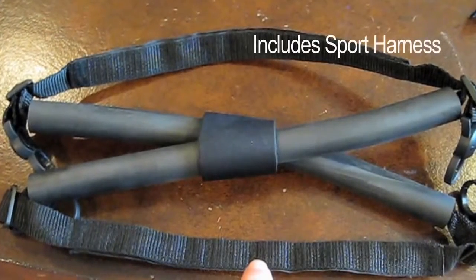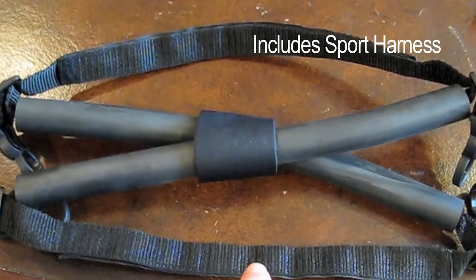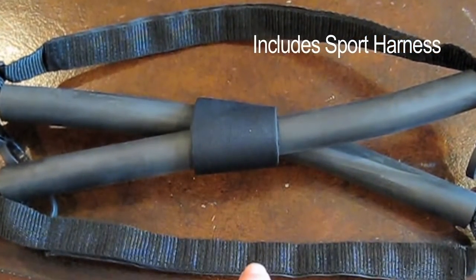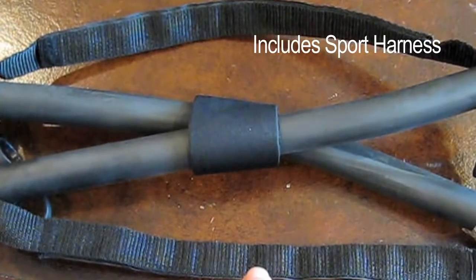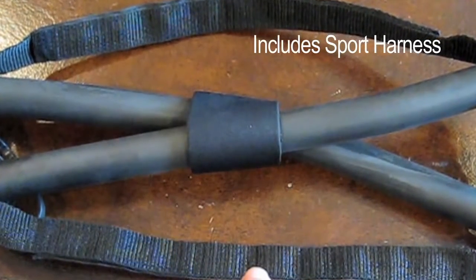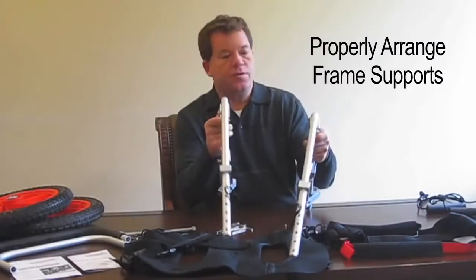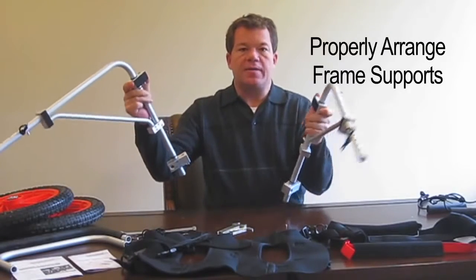Also included only with the Best Friend Mobility kit is an extra sports harness. It allows the pet to move more freely — not quite as much support, but for things like throwing a frisbee or running, this is a good sports harness and it comes free with the kit.